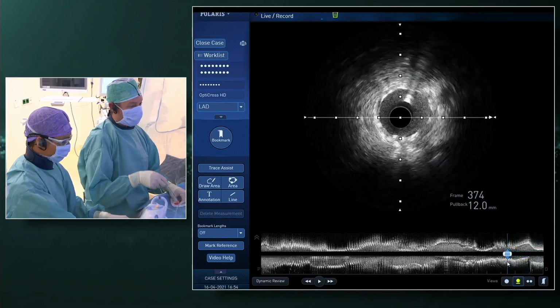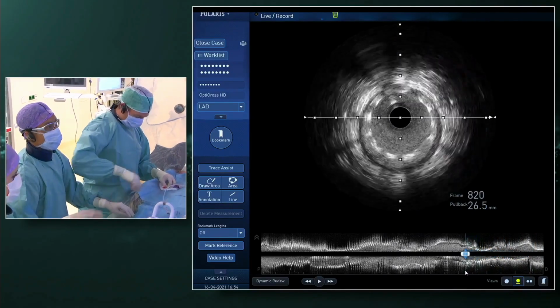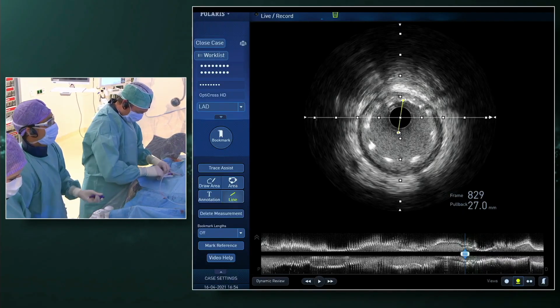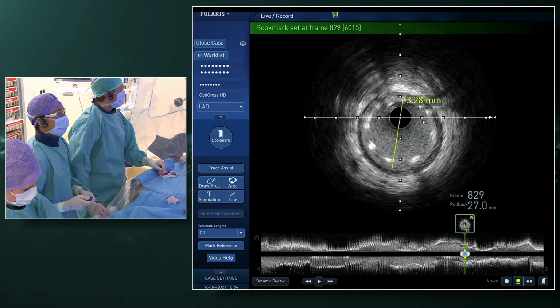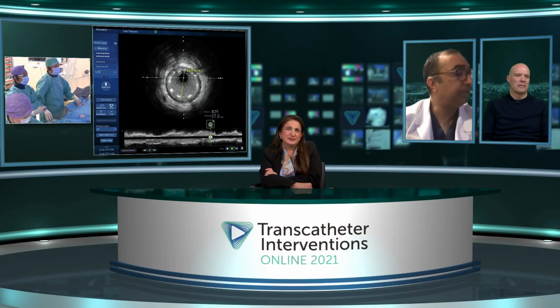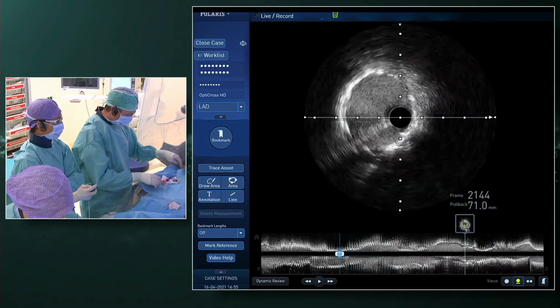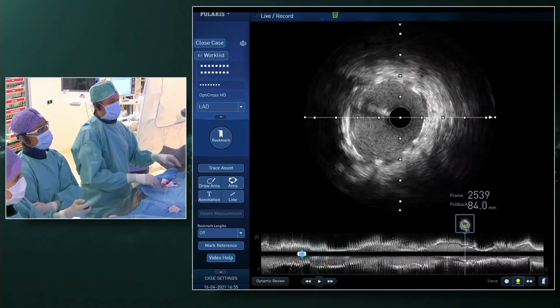So we see distal. It's well apposed here, but we had some malposition proximal, and I'll give immediately the balloon size: if you want to bring this up, we need a balloon of 3.28. Actually, we anticipated that already, didn't we, Joost? That's the proximal edge. Then the proximal stent, it's in general nice and round and apposed.